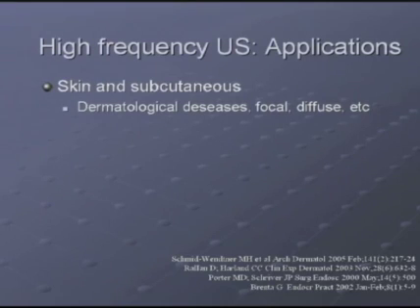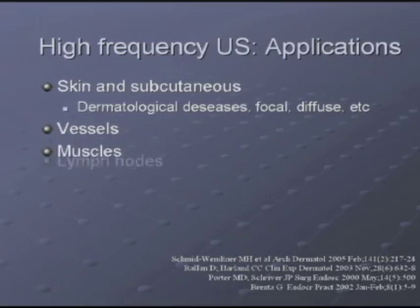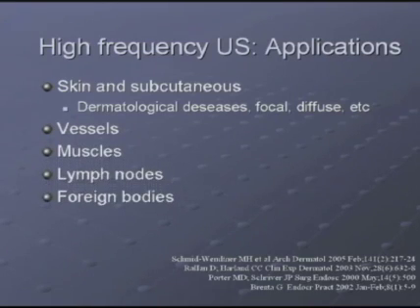In skin and subcutaneous tissue, we can observe dermatological diseases, focal or diffuse ones. We can observe very superficial vessels, muscles, lymph nodes, foreign bodies, and this technique can also be used for fine needle aspiration samples guided by ultrasound.